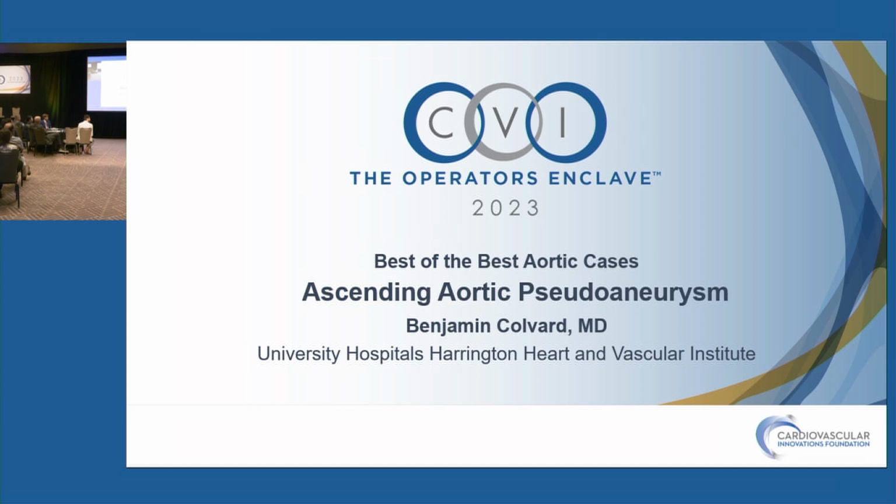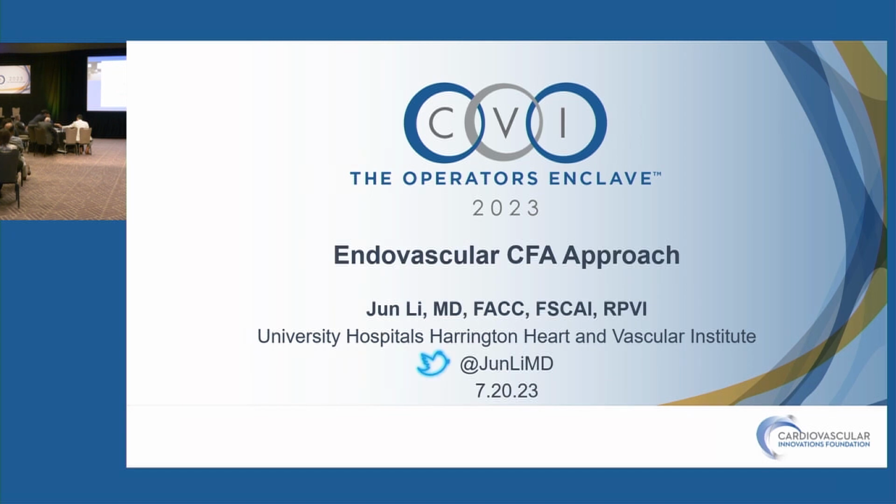So I think to demonstrate this further, there cannot be a greater controversial topic, which is becoming less controversial, which is endovascular common femoral artery approach. Now, there could be many ways to look at this question, but no better person than Dr. Jun Li from Case Western to address this. Jun? Thank you, Subhash. Thank you.